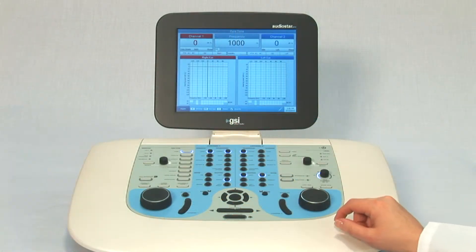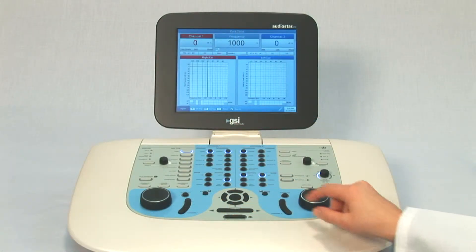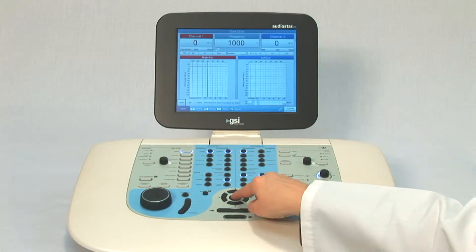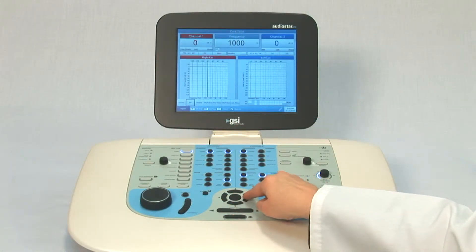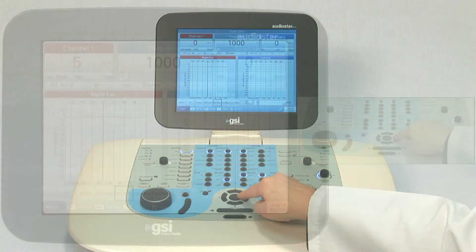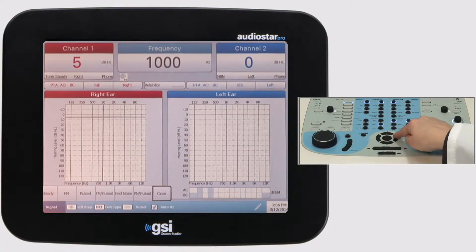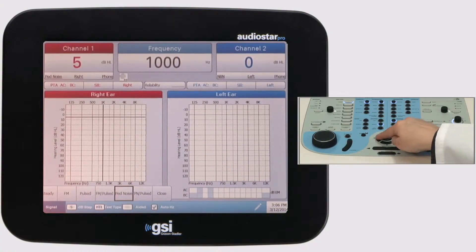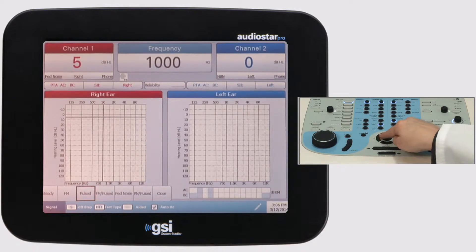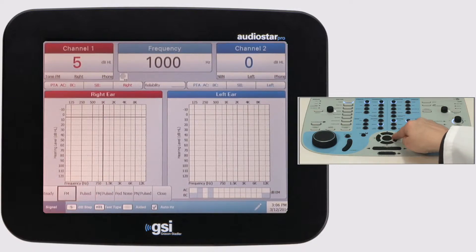This new stimulus can be accessed from the signal menu on the AudioStar Pro. It is also possible to lock the menu in place, resulting in increased speed when switching between warble, pulsed, and pediatric stimuli.